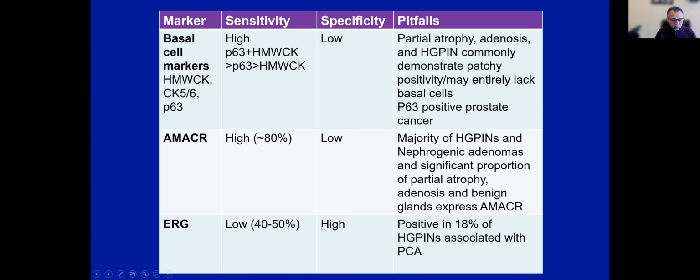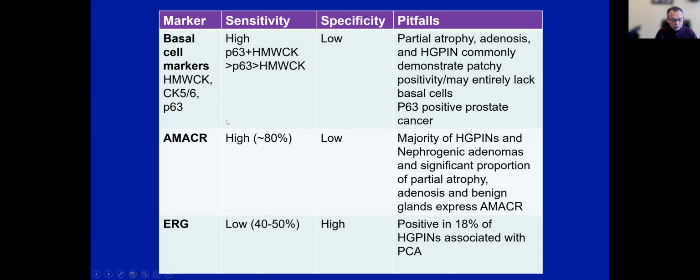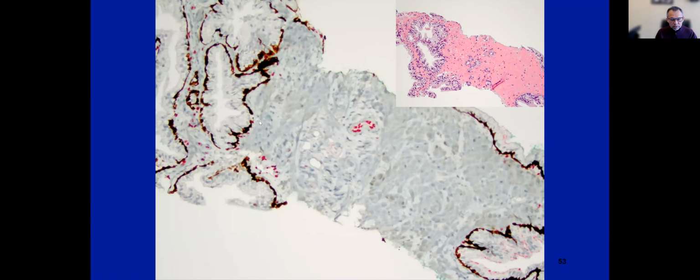But in some high throughput labs, I think we do see use of ERG as a PIN4 cocktail antibody. And keep in mind that these antibodies are utilized in combination as a cocktail, which is referred to as PIN4 ERG, like seen in this PIN4 stain.